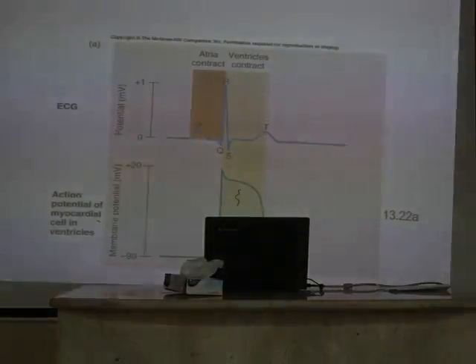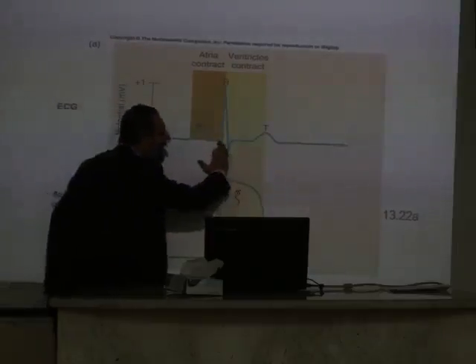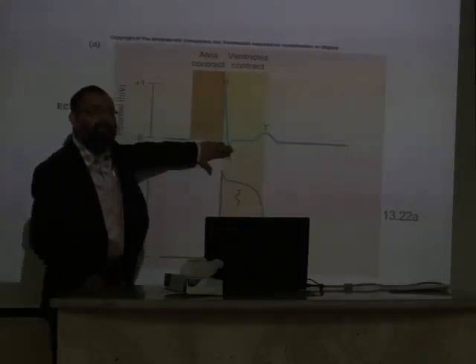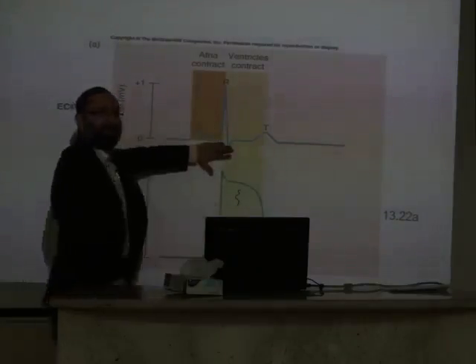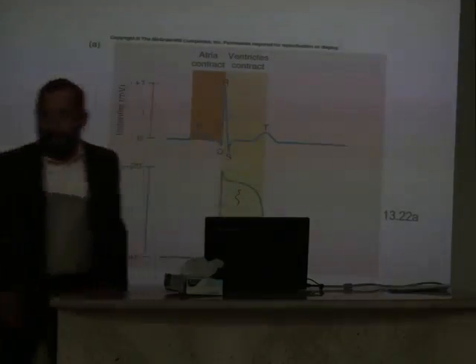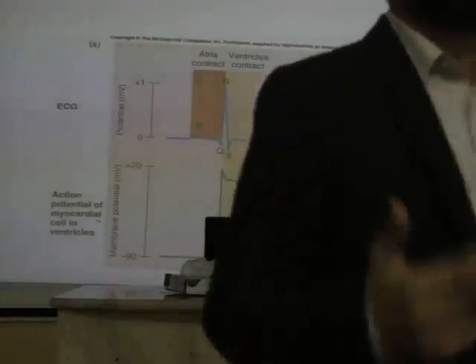So you will call it PQ segment. Very interesting point. Sometimes when you record a normal ECG, the Q wave is not visible. It's not necessary that in every ECG, in every lead, you have the Q wave. Q wave is sometimes missing and you directly start with the R wave. So in the QRS complex, you may have three waves and sometimes you only have R and S wave. If Q is not visible, then what will be the name of this segment?